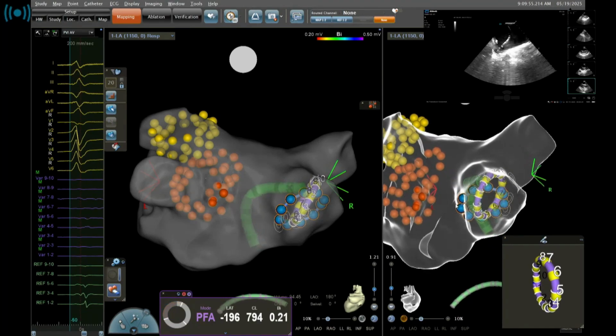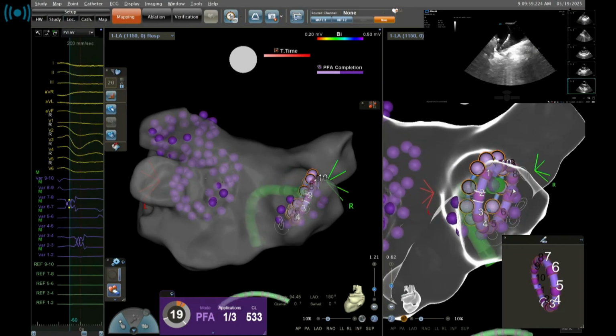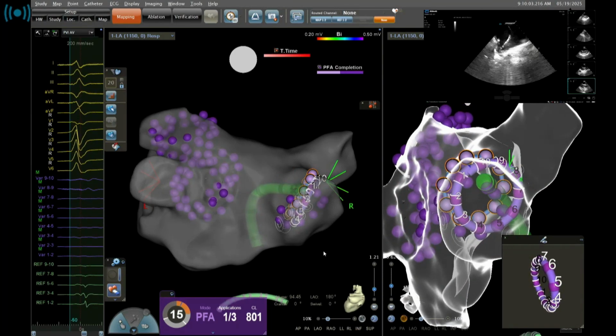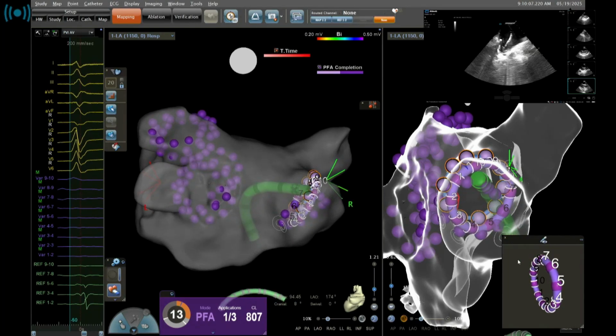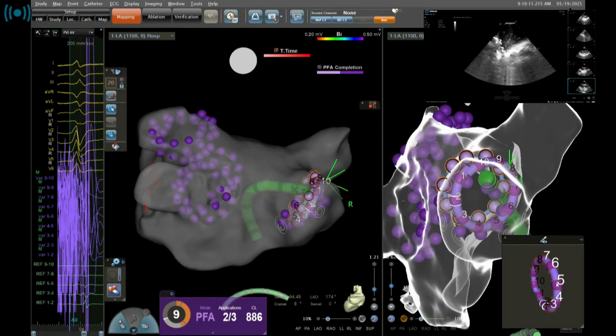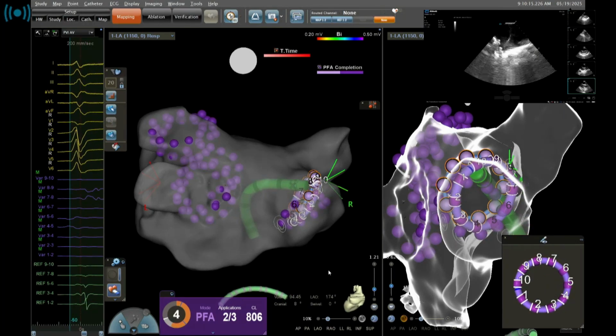Okay, go. We do, I change the 110 position, and I give 2 more. See, this is now touching the inferior part of this antrum. No, this is the ostium. It looks good. Now we go a little bit more out with the catheter position. We are inside.